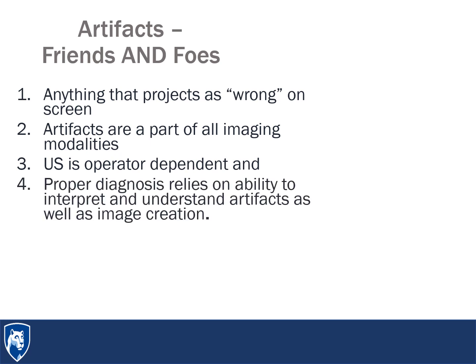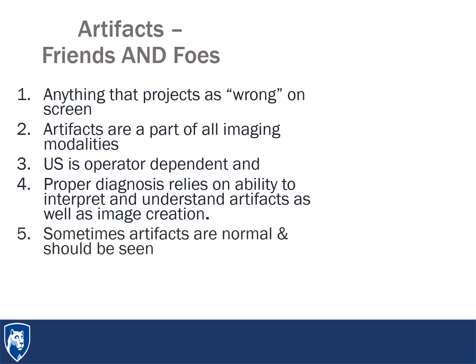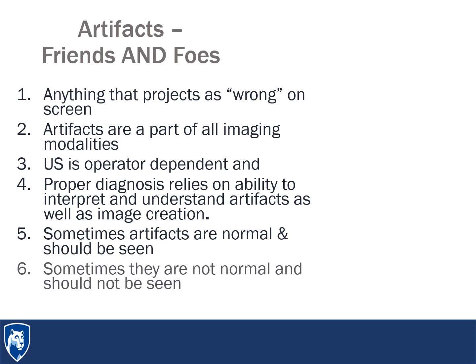Proper diagnosis relies on the ability to really understand this field of ultrasound and artifacts to ensure that you know what's real and what isn't real. And sometimes, as I said earlier, they should be there and they're normal, and sometimes they show up when there's pathology and they're abnormal in that particular scan.